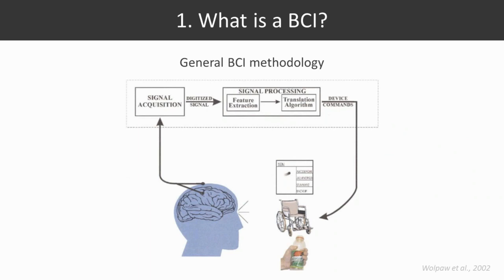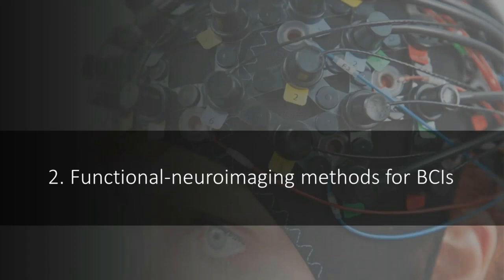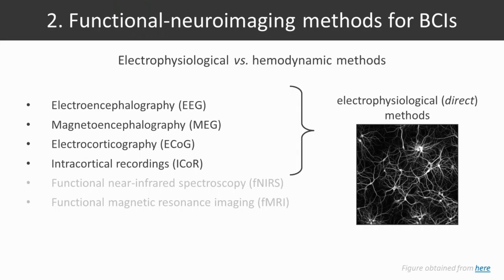These features are then translated into commands that operate a device, for example a word processing program, a wheelchair or a neuroprosthesis.